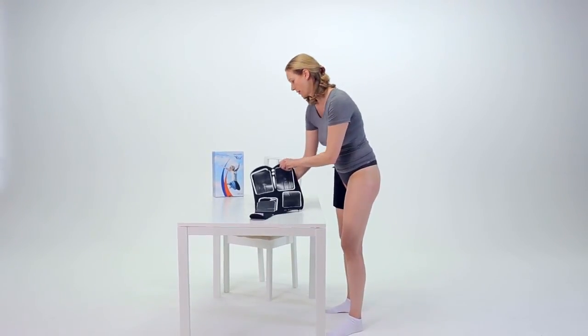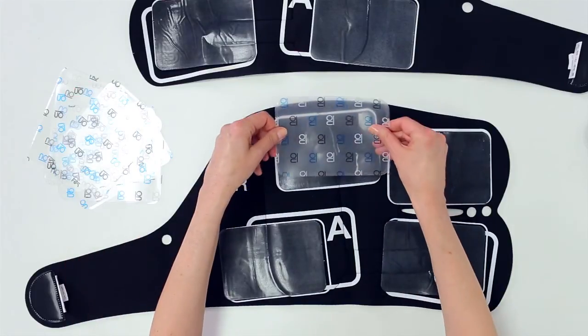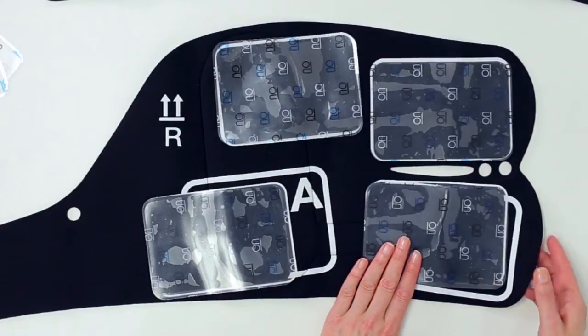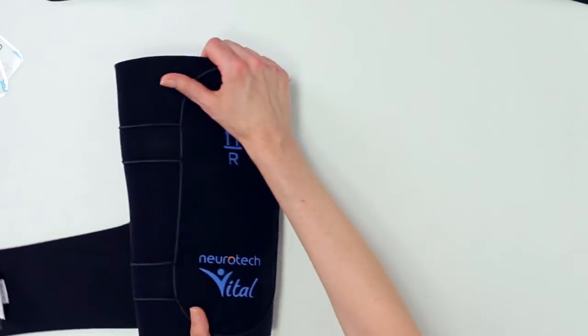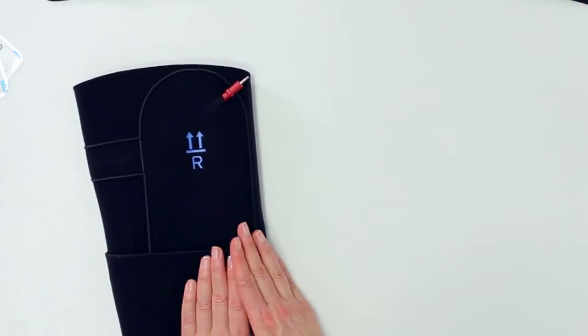Lay the garments on a flat surface and replace the plastic liners on the black side of the electrodes. Fold the garment in half to ensure that the electrodes remain flat when packed away. Store the controller and the garments in a cool, dry place until your next treatment session.